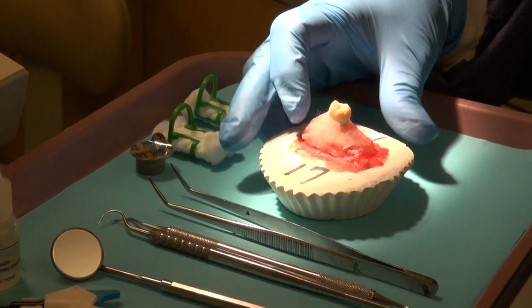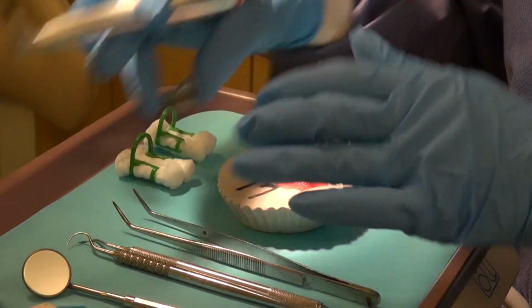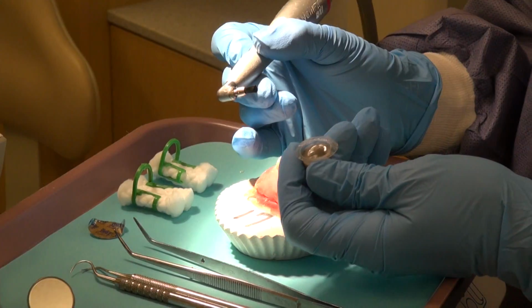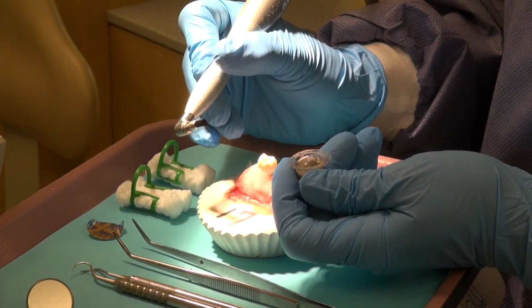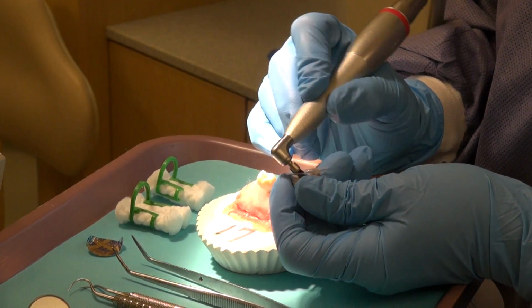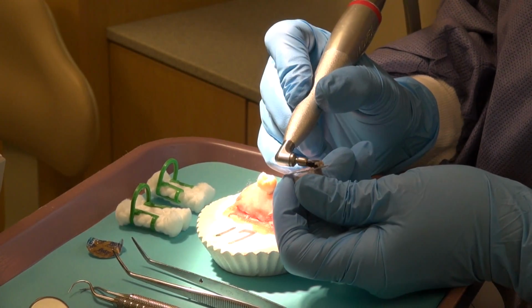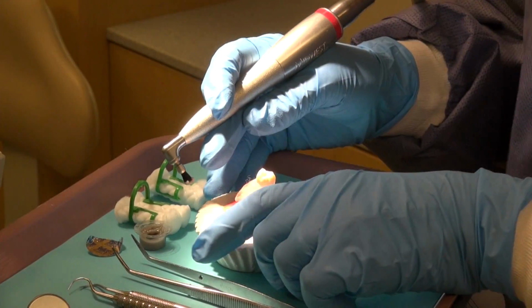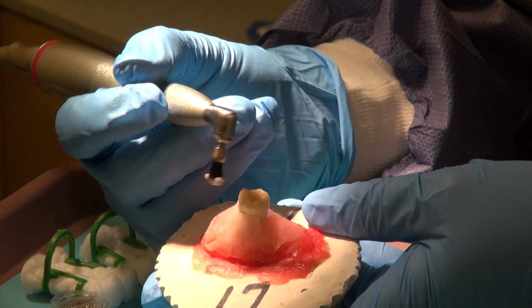We need to make sure that we have all biofilm removed from the occlusal surface, any plaque or debris. Using a rotary brush on an RDH handpiece or a slow speed polisher, we're going to use dental pumice that's just wet with water, no fluoride, and use our overlapping strokes to clean off the occlusal aspect.